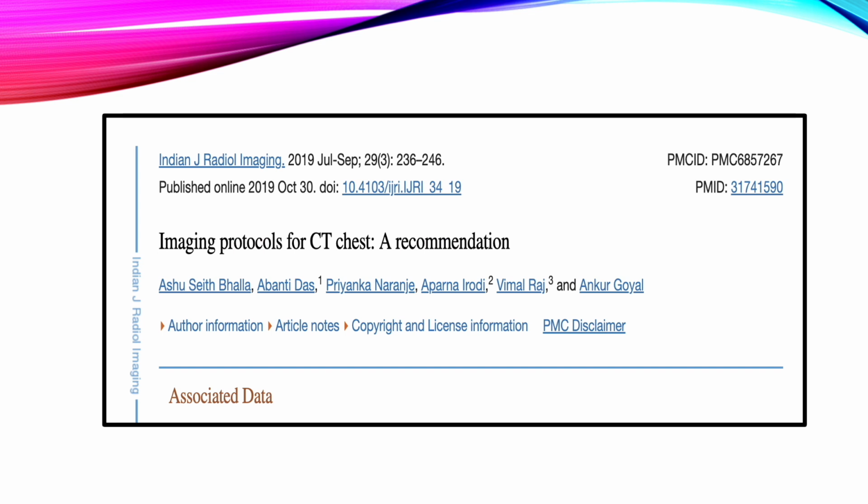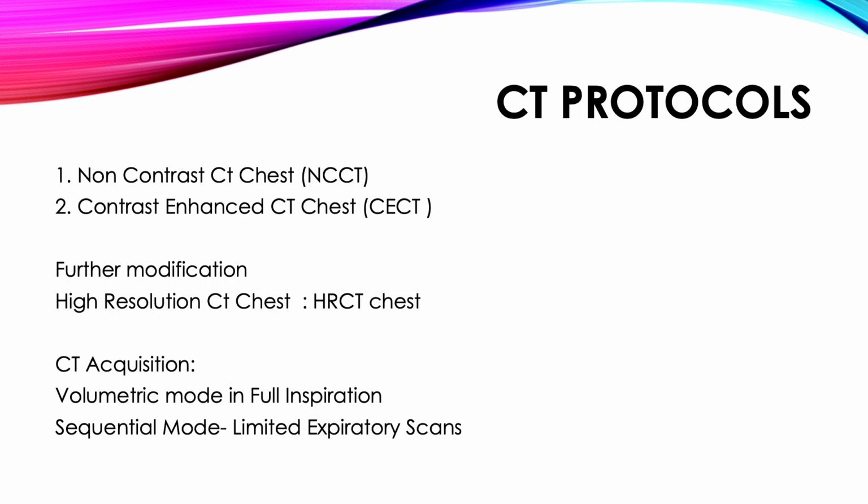So, having said that, today I'll be reading aloud this very nice article which was published in Indian Journal of Radiological Imaging in 2019, which talked about imaging protocols for CT chest and the recommendations. Before we discuss the various signs and appearances on CT scan in various diseases, it's important to understand when and where a CT scan needs to be offered, in which format and which protocol, because there's usually a lot of confusion around it. So the first video in this series would be on imaging protocols.